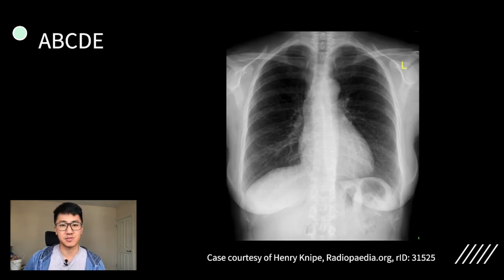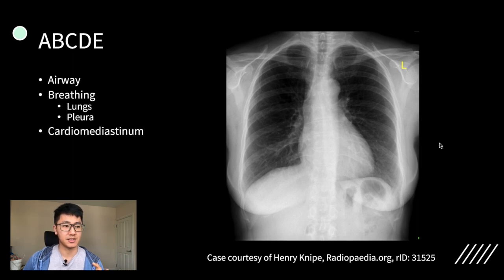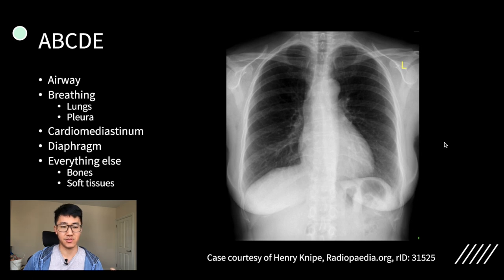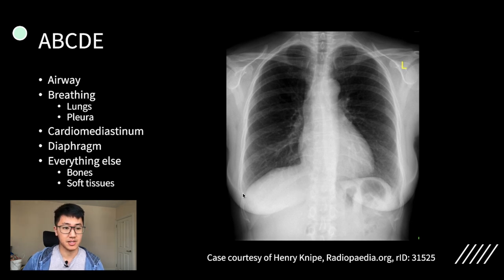Now let's look at the actual search pattern. Most people will use an ABCDE structure: airway, breathing, cardiomediastinum, diaphragm, and everything else. For airway, I start by looking at the trachea and making sure it's fairly midline. For breathing, I compare the lung field side by side, looking at the upper zone on one side and comparing it with the other side, then going through different zones. Don't forget to look at the pleura as well, so make sure you look at the costophrenic angles in case there's a small effusion. Follow the edge of the pleura and look for pneumothorax right into the apices on both sides.